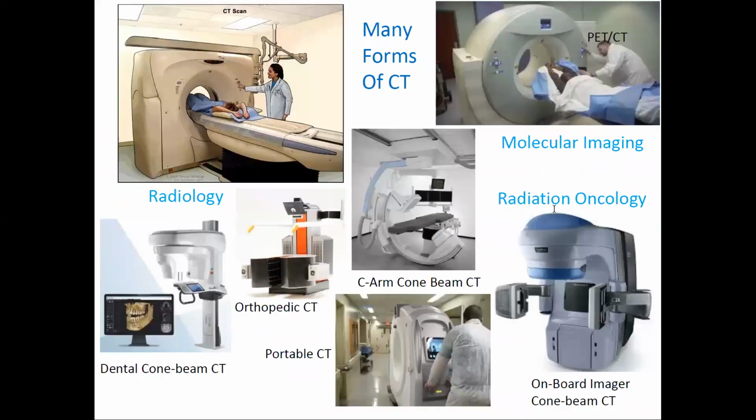So CT has a huge clinical application in many forms, in 3 parts of the medical field: both for radiology and for molecular imaging with PET-CT, and for radiation oncology. In radiation oncology and molecular imaging, you have a multimodality going on.